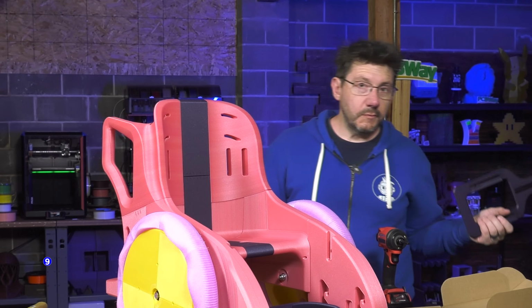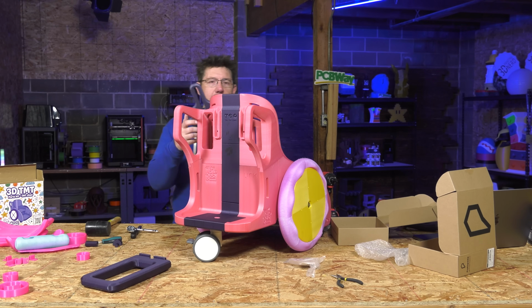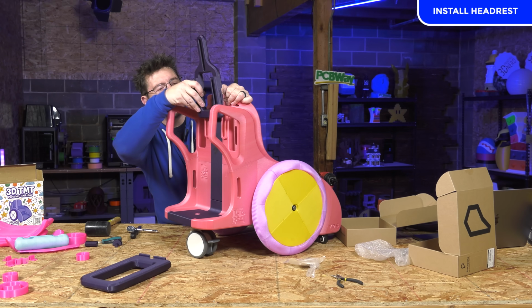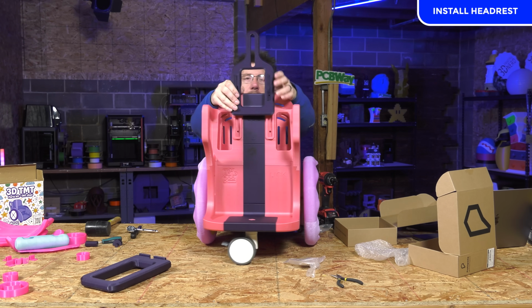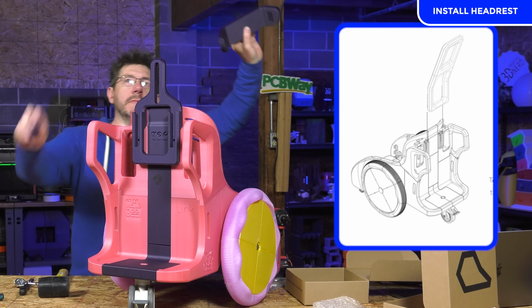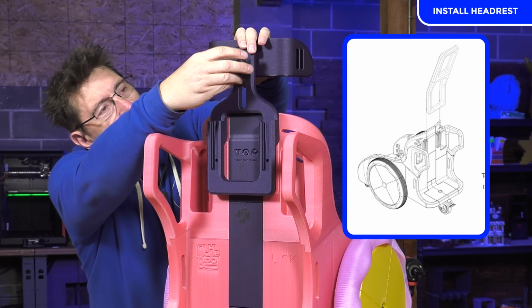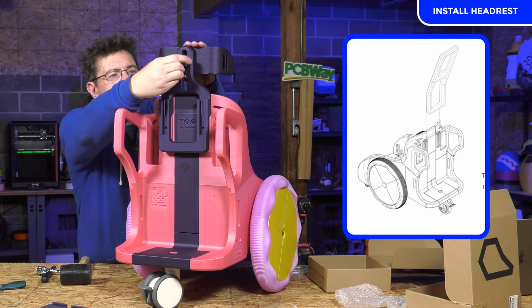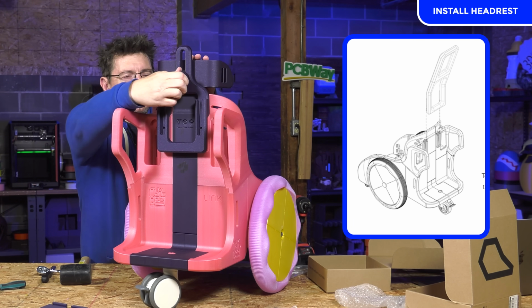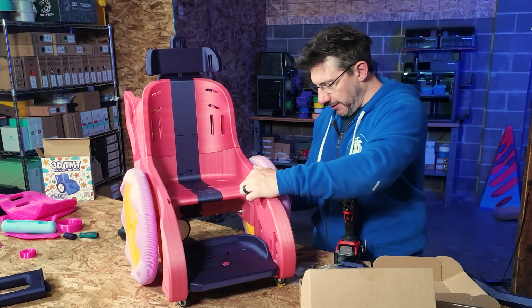That's really awesome. Now we've got the headrest mount. That's gonna go on the back. And there's these really cool rails that things fit into. So if I just slot that in right here, this is the headrest mount. This is the headrest bolt. It goes in like this. And you put the bolt in. And then if you tighten it down, you can adjust the headrest into any position. These little bits go in the wheels to cover the bolts.